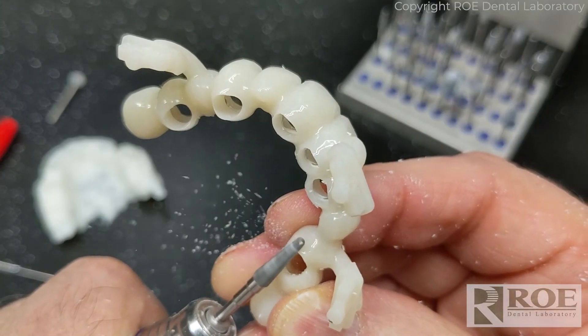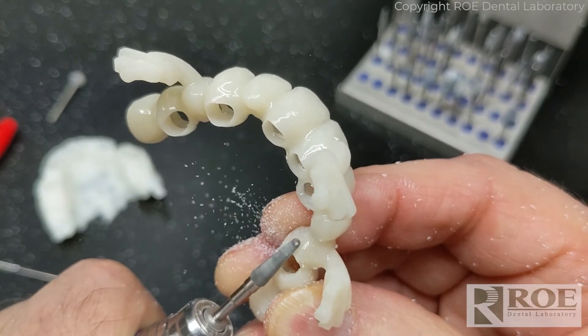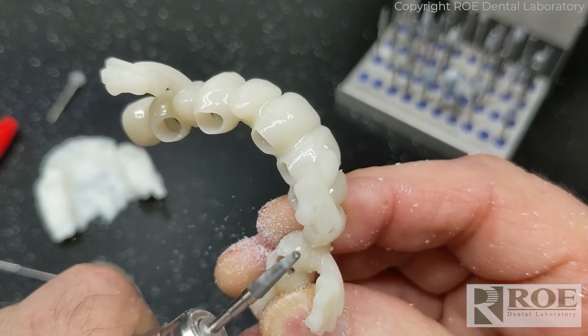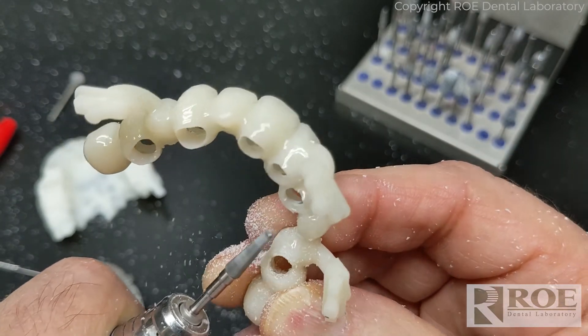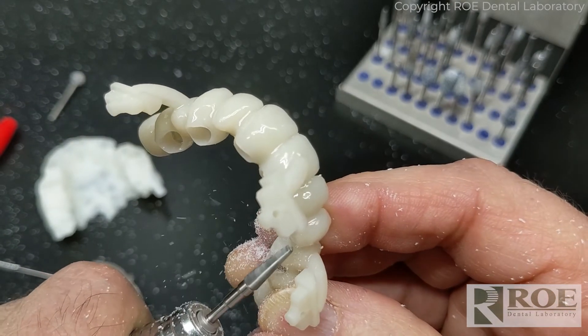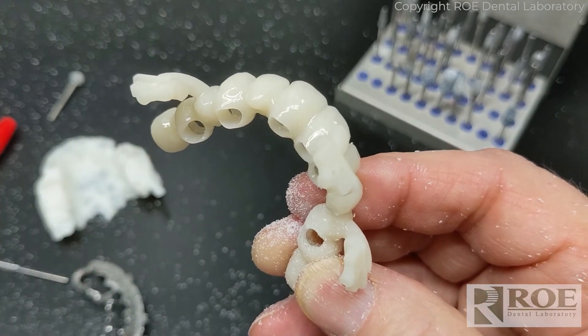I'm going to adjust a little bit on the ridge lap of the pontic, just to make room for some soft tissue between the ovated area we formed in the bone, so that it ends up with a little ovate depression in the tissue when we make the final restoration.